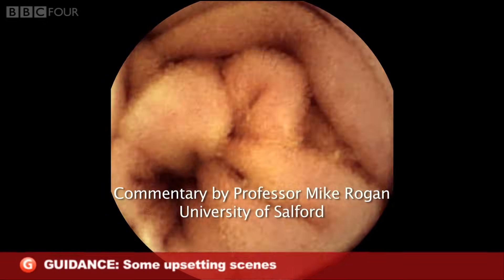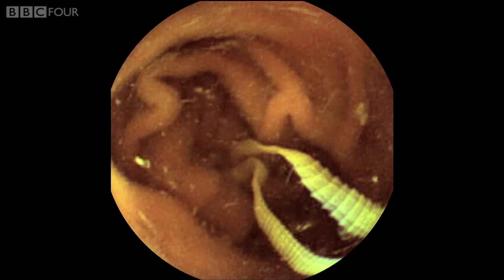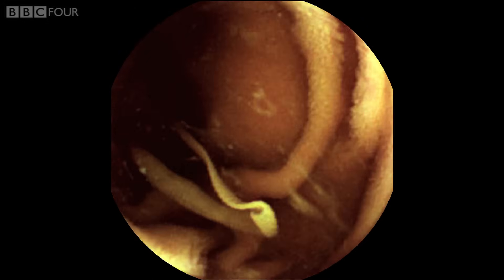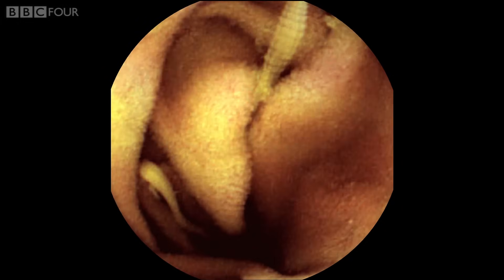We're just at the start of the small intestine, and we can just about see — this is the first glimpse of one of the tapeworms. This worm is probably between one and two meters in length. You can see how closely the worm is associated with the intestine; the wall of the intestine is closing in around the worm, so it's very tightly adhered to it. The segments themselves increase in size as we move down the length of the worm, and this is still quite near the front end, because these segments are quite shallow.